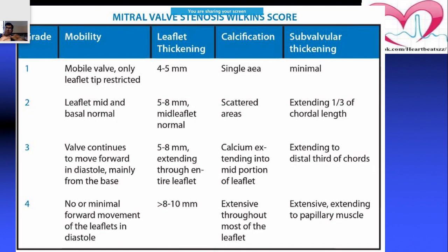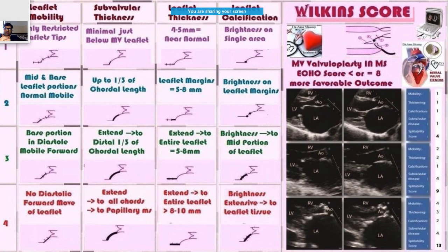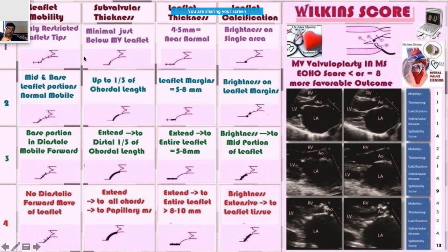Grade 4: Minimal forward movement of leaflets; quite significant leaflet thickening; extensive calcification present throughout most of the leaflet; subvalvular thickening extending up to the level of the papillary muscles. Please go through the slides showing how each grade appears visually — spending time on these will give you a lot of practical understanding.